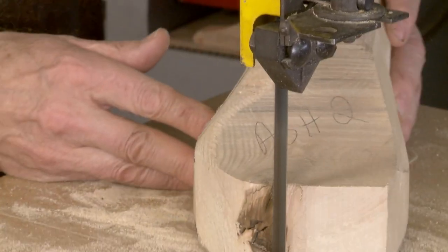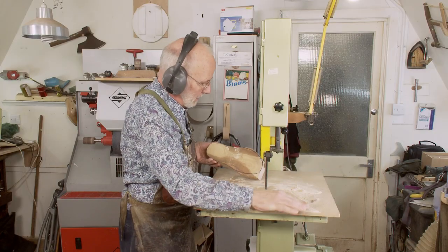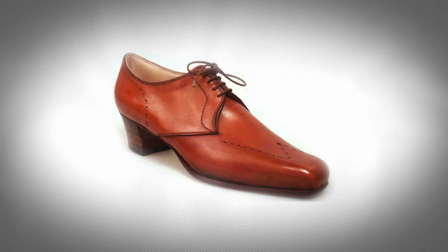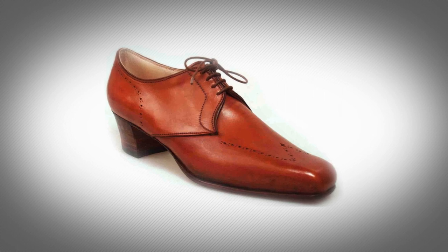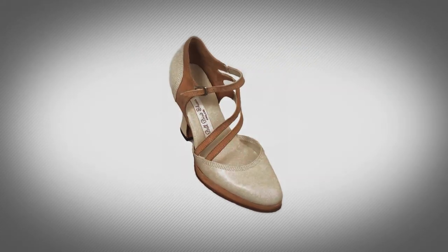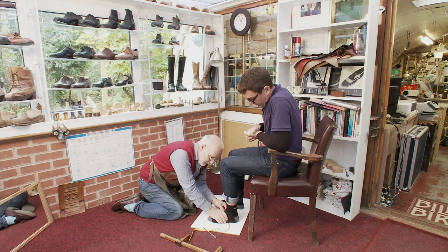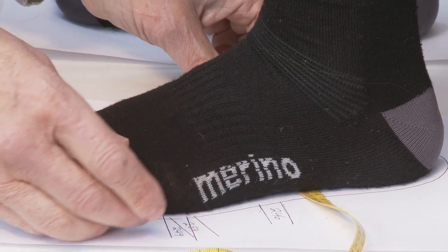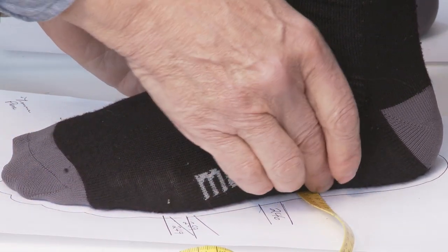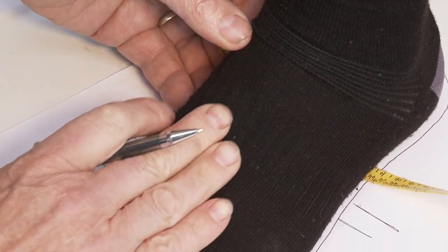In this video series, we focus on the highly specialized skills needed for making elegant, stylish footwear for people with fitting and walking difficulties. There's a lot of educational material on making shoes on the internet. However, here you will learn how you can transform a person's life through applying the concepts used by the bespoke orthopedic shoemaker.